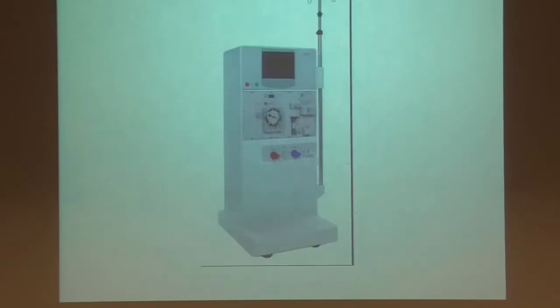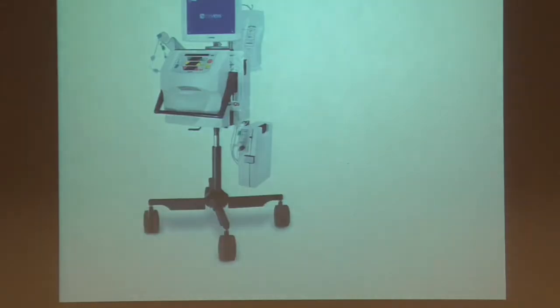And these are normally machines like this. This is like a NxStage machine. Fresenius, the company we work with, actually bought this company for a couple billion. This machine actually started off as a home dialysis machine. Because of its slower dialysate rates at home, they flipped the market and got into CRRT. These machines run for about 36 hours. After 24 hours, you have to switch out the cartridges.